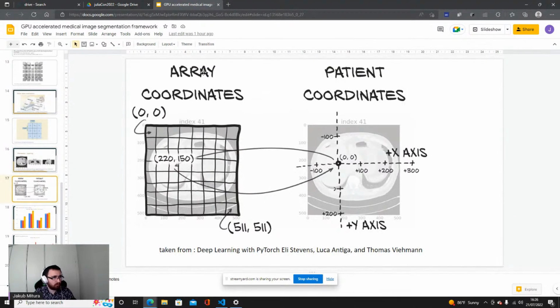And this is one more time, yes? You have some array coordinates, like this point. And then you need to be able to say where physically it is. So how many millimeters from other point? In order to know it, you need to know the direction, the origin, and the spacing. So you need to know that, for example, moving 3 voxels left, right, means that you moved 3 millimeters, or 5 millimeters or 10 millimeters. It depends on the spacing, okay?